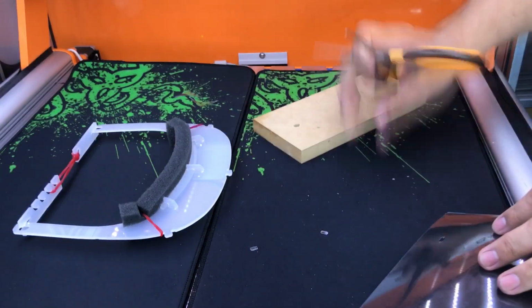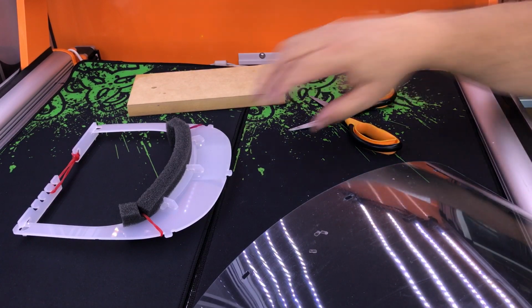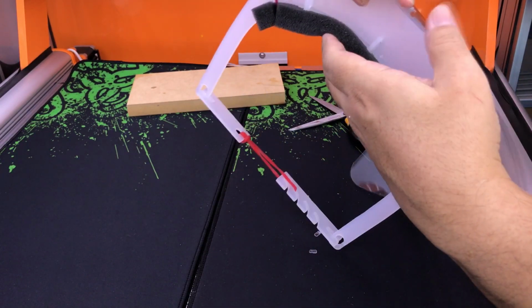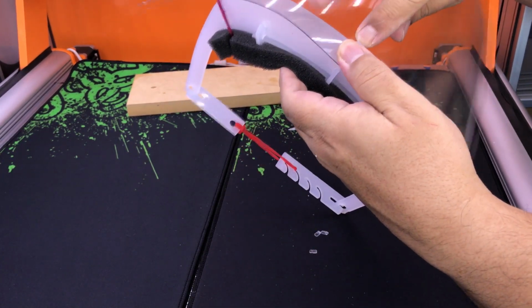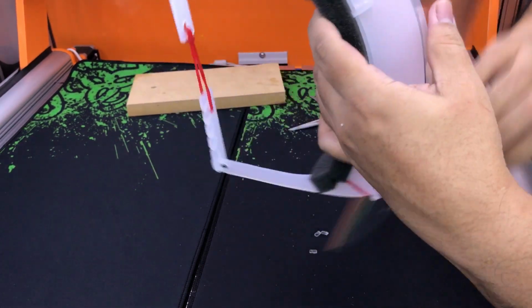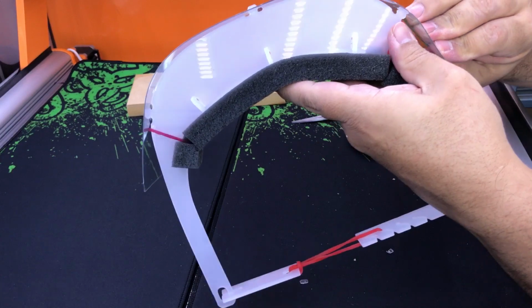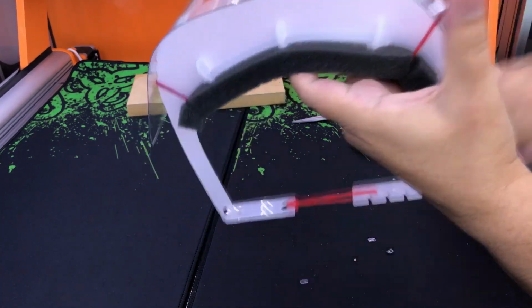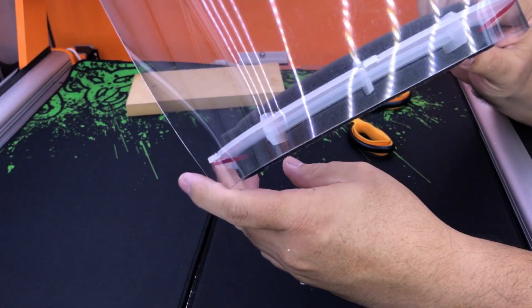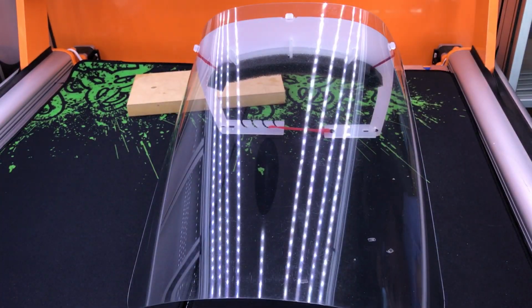Okay, now we remove these three parts. We have the holes, and the holes fit perfectly here. You put the middle one first. So when you press it, it will open the sides and then close the sides, so it doesn't move away. Then after the center, you put one of the sides, then the other side, and that's it. That's how the mask is finished. So it's not difficult, it's very simple to make.